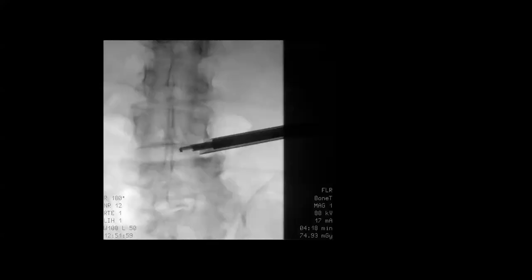So you see from the right side, we come with an endoscope transforaminal approach. You see the burr now, it's a diamond burr, very small, very tiny, from my point of view. And it's very slowly approaching the foramen. You see, stepwise, I get into the foramen. I have to drill away a lot of osteophytes and lateral aspects of the superior articular process, the SAP. And then finally, I'm in the foramen. Here, I'm taking away some ligamentum flavum, which is accessible via the foramen.